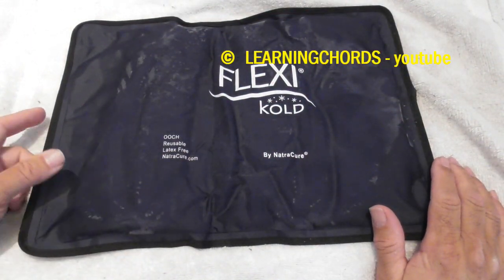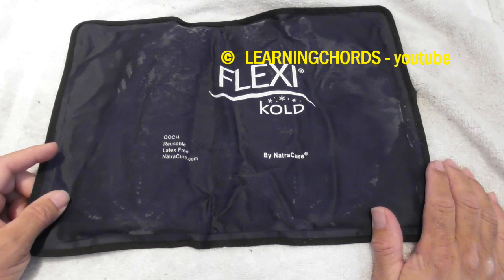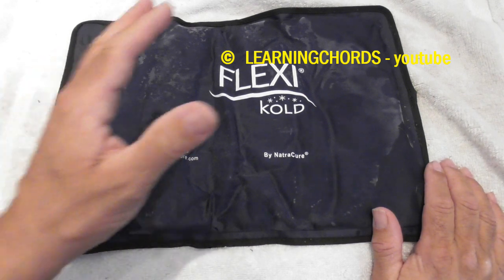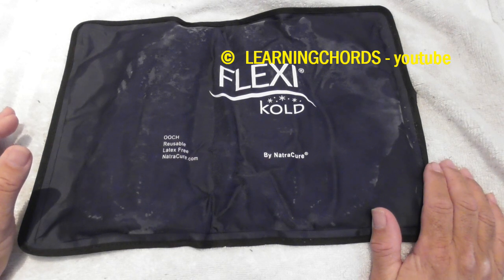So having this FlexiKold ice pack, it's a lifesaver because you want to do four things. You want to do rest, ice, compression, and elevate. You want to rest your body when you're injured. You want to ice it to lower the swelling. You want to do compression, maybe an ACE bandage or some type of a brace for compression, and you want to do elevation. You want to raise your injured hand or whatever's injured above heart level to make the blood have to pump upward and stop the swelling.